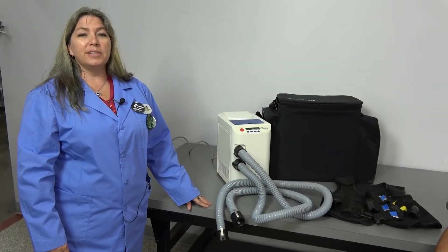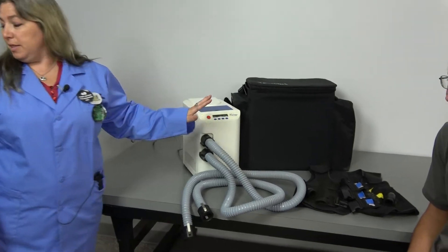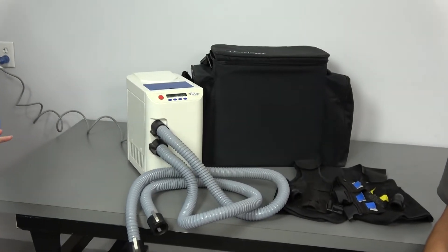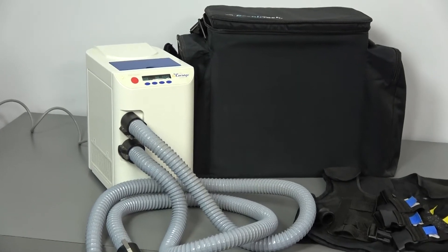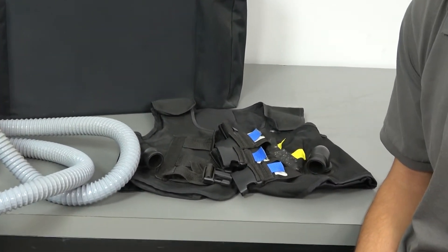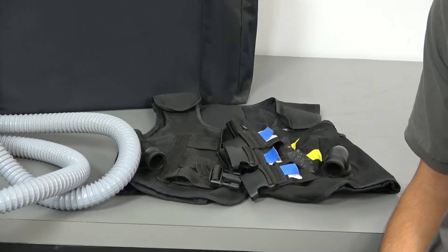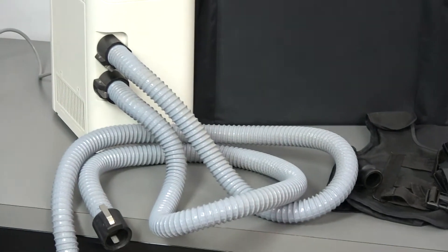I am Lori and today at New Life Scientific we're going to take a look at the Encourage by Respitec. This particular instrument is designed to help those who have excess mucus issues that may impede the lungs and airways from fully functioning. The system has a vest attached to a machine that creates compressions to the chest which may help loosen, thin, and move mucus through the lungs.